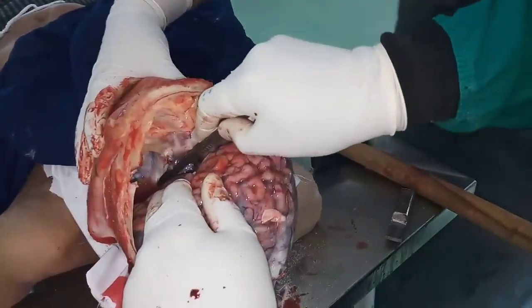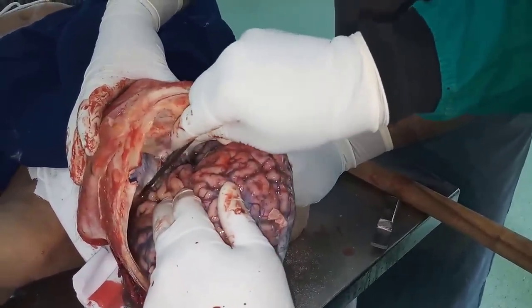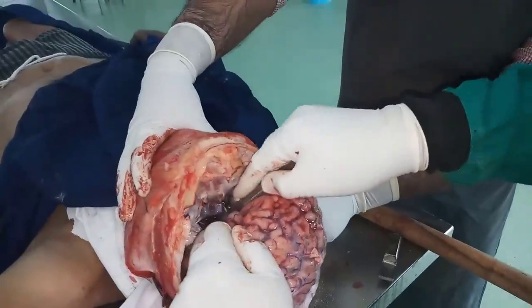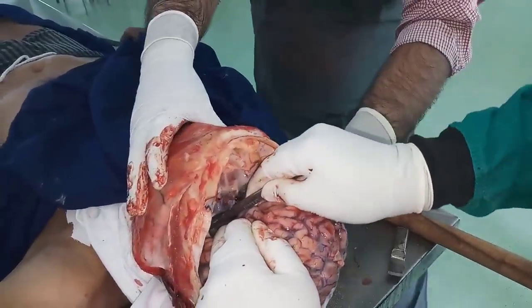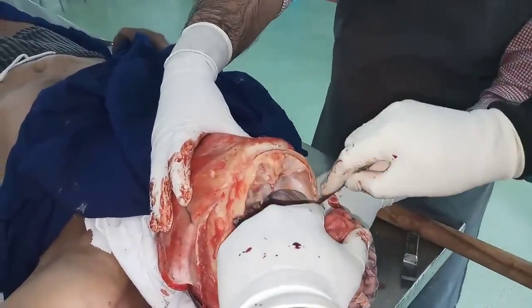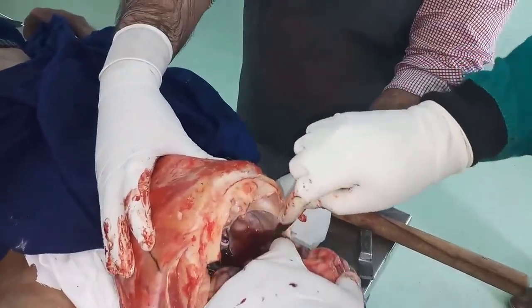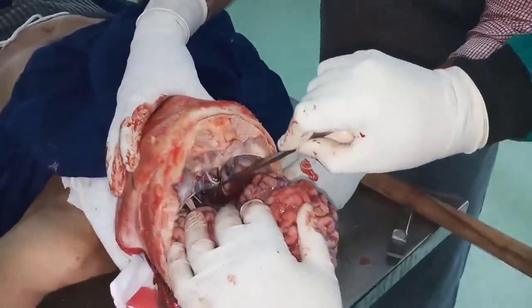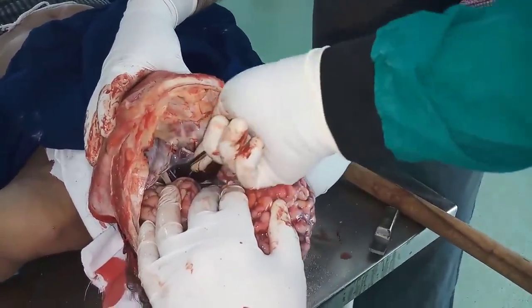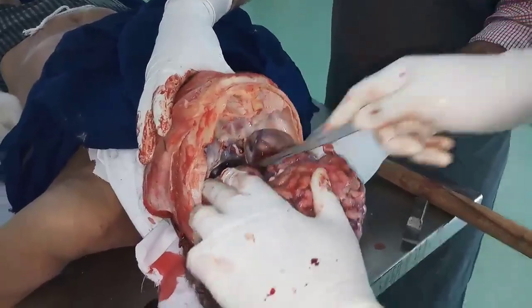Below I can see the tentorium cerebelli. I'm cutting the tentorium cerebelli on one side. We'll cut the tentorium cerebelli of the other side also. And simultaneously I will put my knife in the foramen magnum to give a cut over the spinal cord. So this spinal cord is cut.